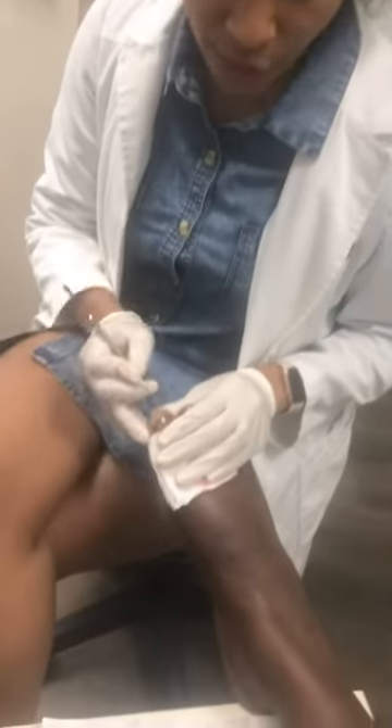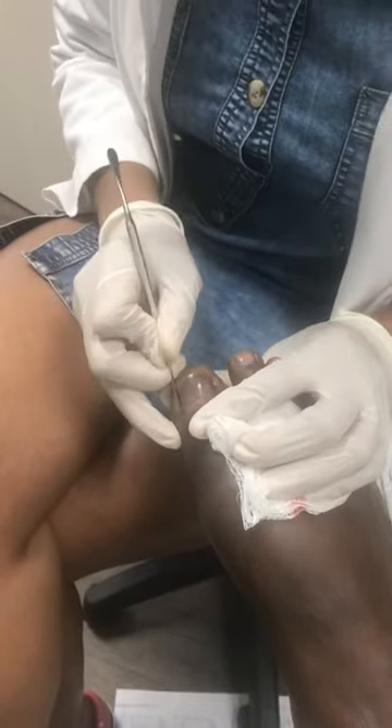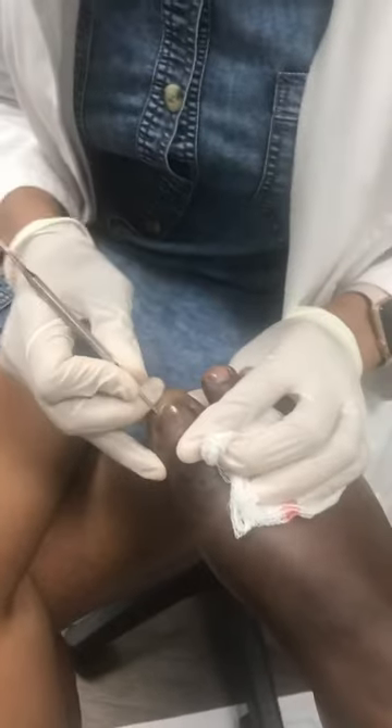He's already numbed up. If you come a little closer you can see. I have pushed back the cuticle. He doesn't feel anything I'm doing. I'm going to lift the nail up.